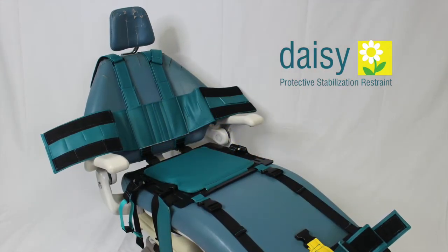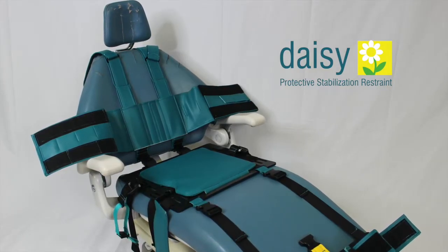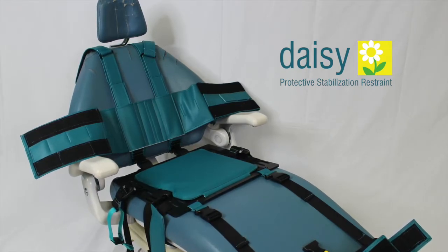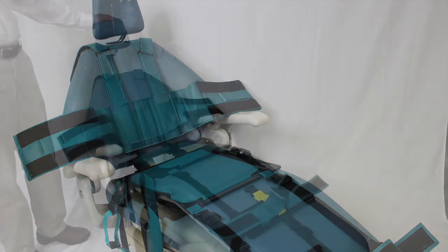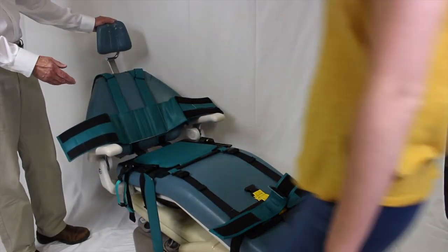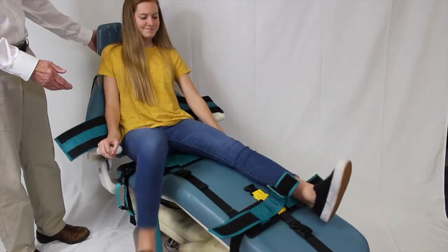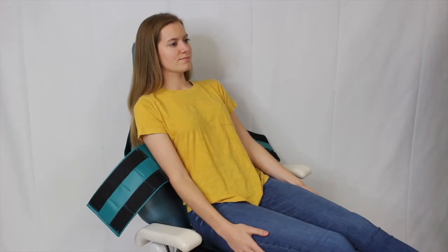Before the patient arrives, open up all the wraps before the patient sits in the dental chair. This will be less threatening to the patient and caregiver, allowing them to feel the comfort of sitting on the dental chair before applying the wraps. Position the patient in the dental chair, allowing them to get the feeling that they will be experiencing something similar to their car seat. This will make the DAISY more acceptable to the patient and caregiver.